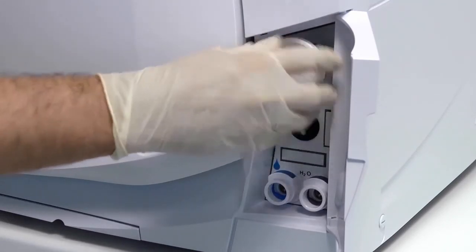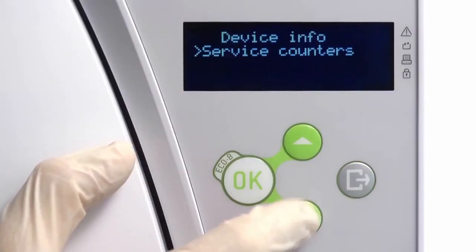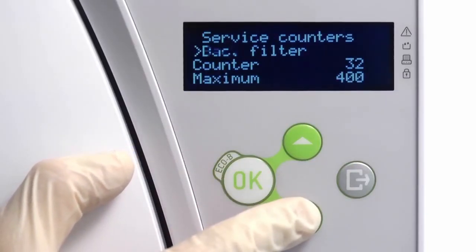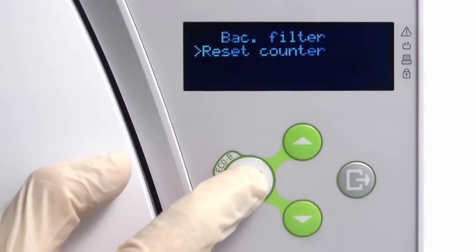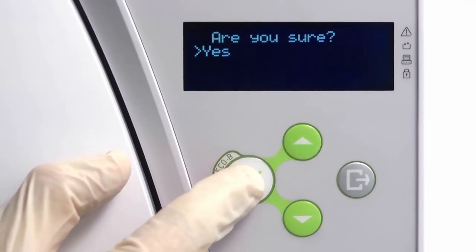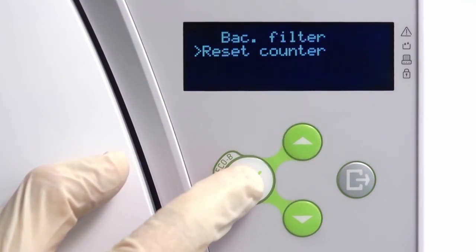Once a new filter has been fitted, navigate to the service counter screen within the menu. From here, you can perform a manual reset of the bacteriological filter counter. Resetting the counter will ensure that the maintenance reminder automatically reappears after another 400 cycles have been completed.